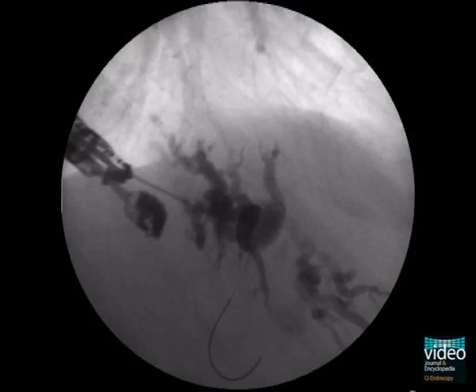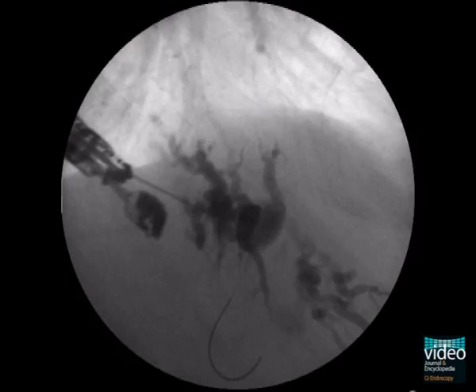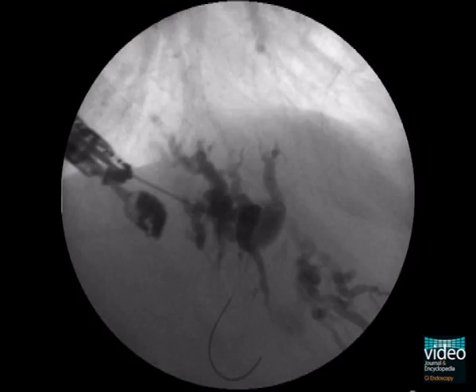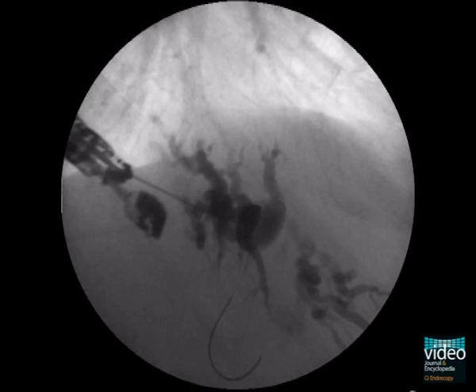This maneuver can be observed real-time with fluoroscopy. The guide wire should be introduced as far as possible to achieve a stable position for the next steps.